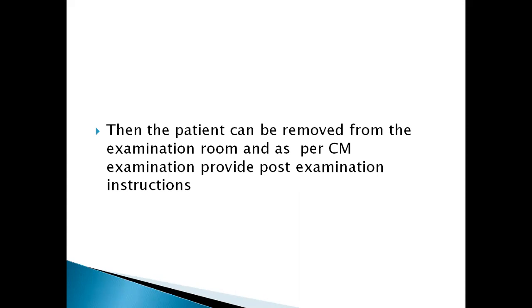But for this one, because the doctor may have also administered beta blockers, you may want to check the blood pressure. And once the nurse comes to get the patient, also advise them that periodically they can check the blood pressure of the patient to make sure that it doesn't go too low. And other instructions that you may want to give the patient is also how to get their results and whatnot.